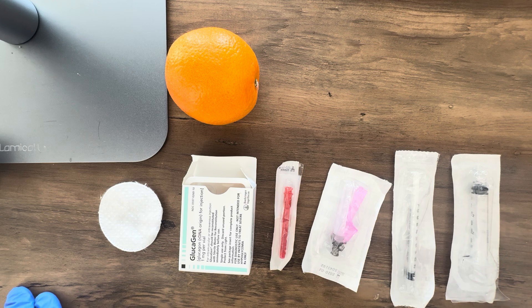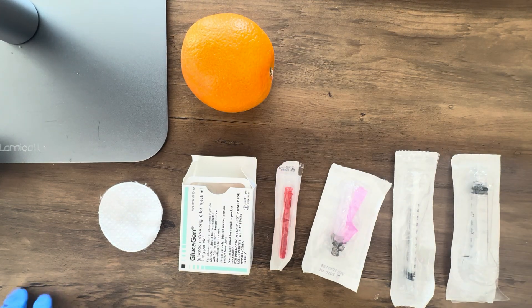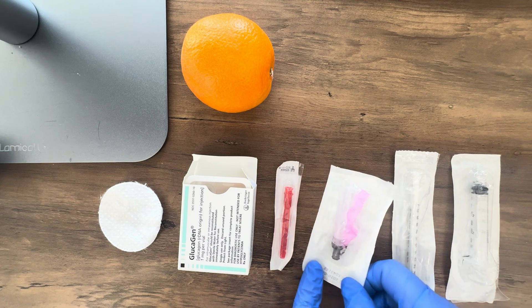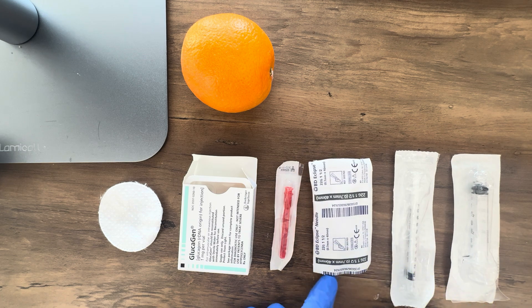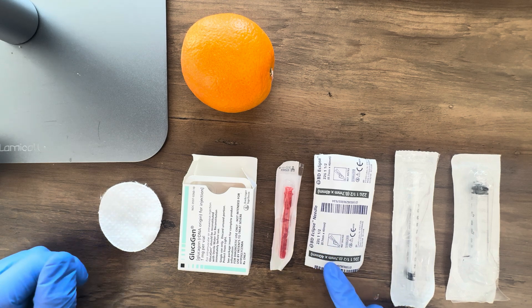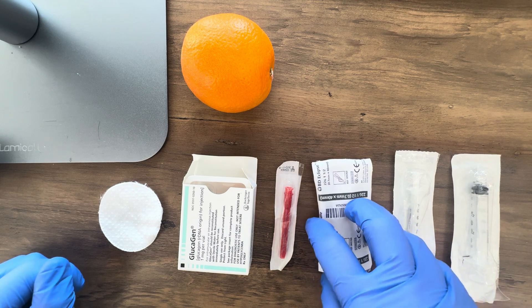You're going to need a couple things to get started. Today we're going to be using an orange as our patient, but you'll need an alcohol pad, your medication, a blunt fill needle, and your IM injection needle. For IM injections I use 21 to 23 gauge needles that are either one to one and a half inches long. This is a 22 gauge needle that's one and a half inches, so that would be appropriate for the IM injection.